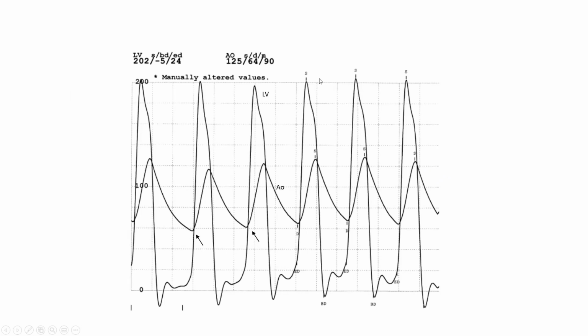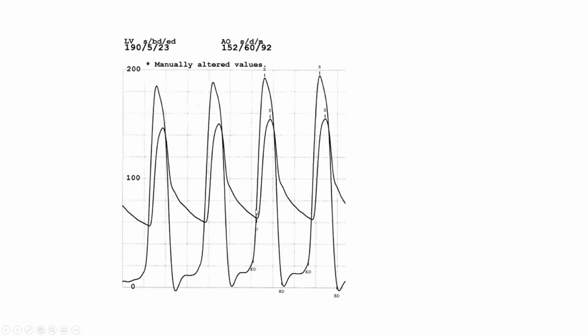So this is another case. This is the case I've done. So you can see LV aortic pressure. Again, it strikes that aortic pressure is too smooth. Okay, no dips, no dicrotic notch, no anacrotic notch. So it's too smooth. It's clearly damped. So here it was easy. We flush our system, shorten the tubing, shorten the number of stopcocks, and it's a very different pressure recording.